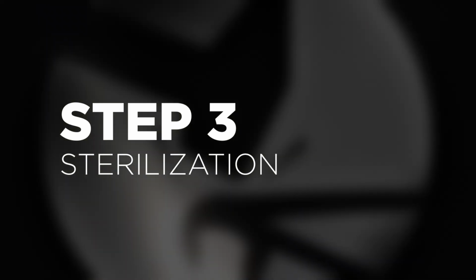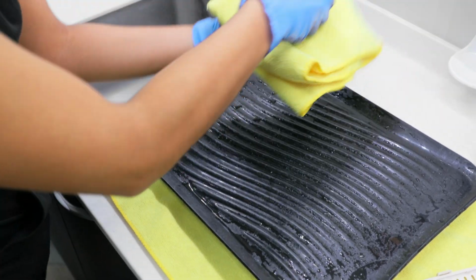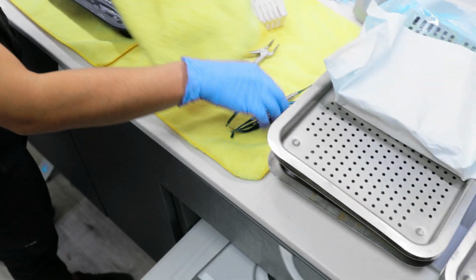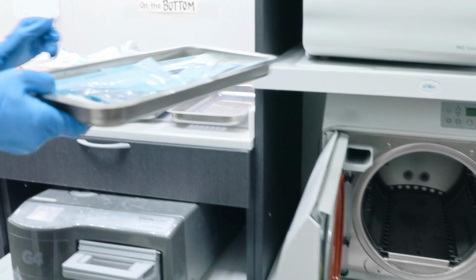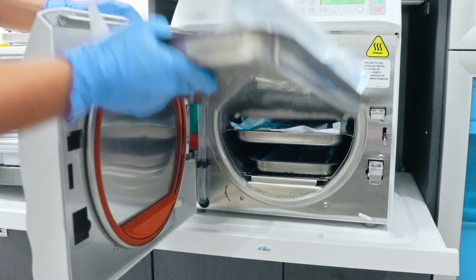Step 3. Sterilization. To retain the value of the instruments, it is very important that they are completely dried prior to sterilization, as residual humidity can cause corrosion damage. Sterilization is performed most commonly with saturated steam, usually at 134 degrees Celsius.